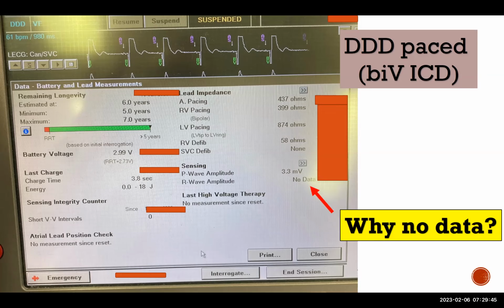What I'll often do is drop it down to, just like you said, about 50, then maybe 40, and then to 30. But I won't let the patient sit at 30 for more than about 3 to 8 seconds, because it's very uncomfortable, particularly if you have a normal heart rate most of your life. So I'll just drop it down briefly. And if I do not see an R wave come in, then I just come off and say that we were unable to assess the R wave. And that's not uncommon in people who have a heart block.